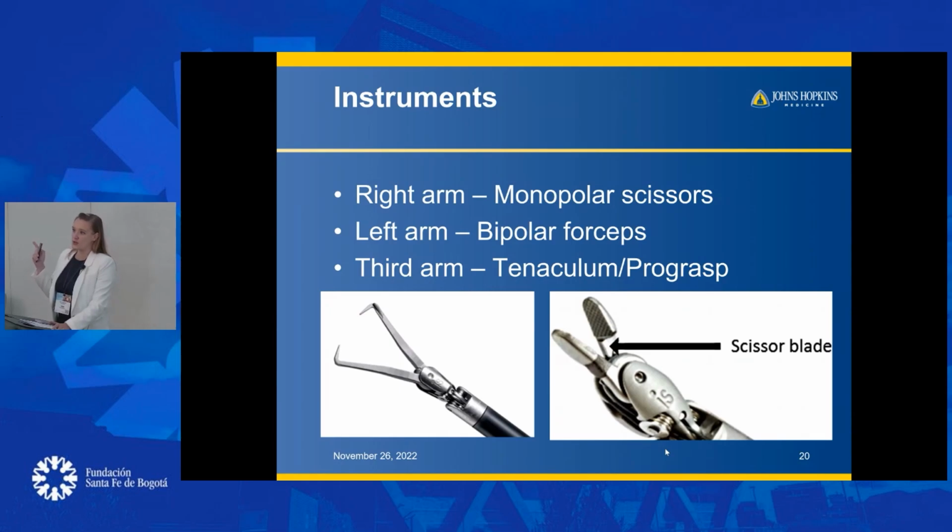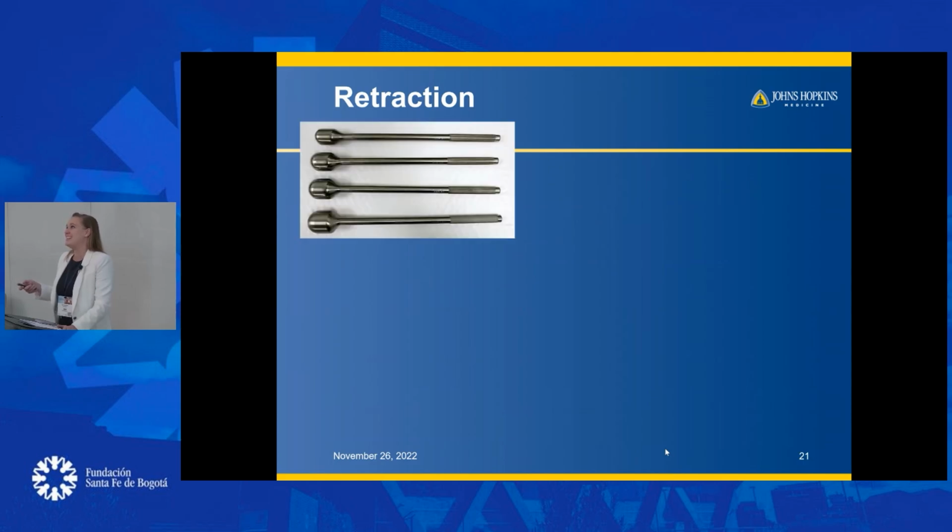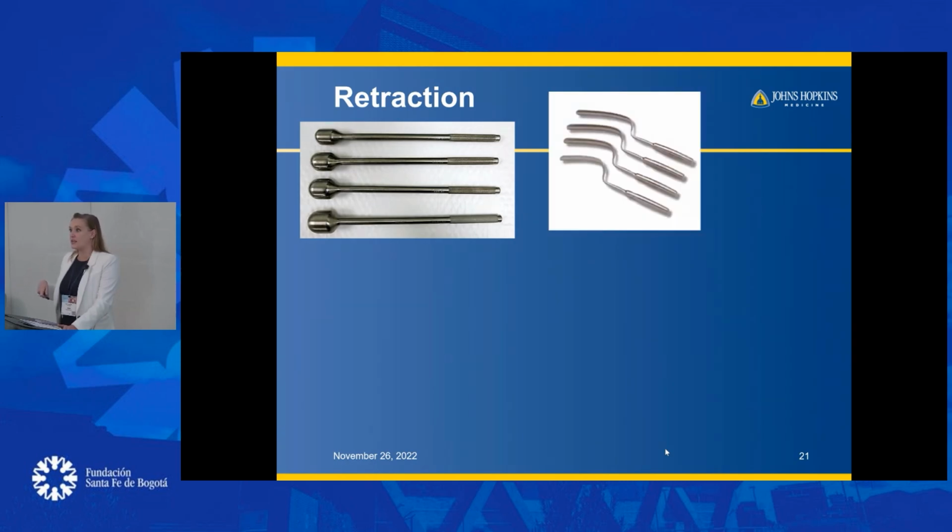And these are the scissors that I was talking about, your grasping scissors. You have to be very careful, because if that suture flies right into that space, you're going to cut it by accident. So there's a learning curve, I would say. So from retractions, people use EEA sizers. That's probably what a lot of people do. You can also use a Breisky, which is actually really nice because it flattens the vagina and kind of aids in the dissection a little bit.